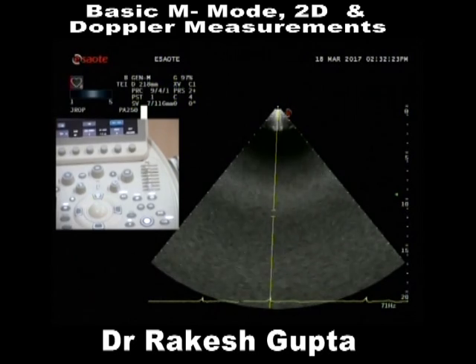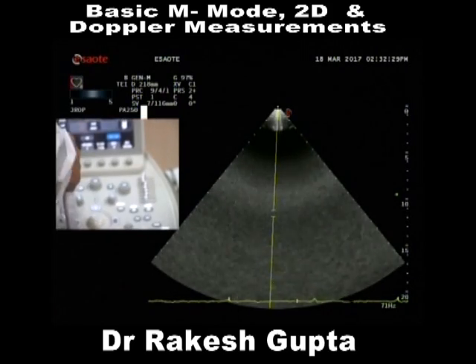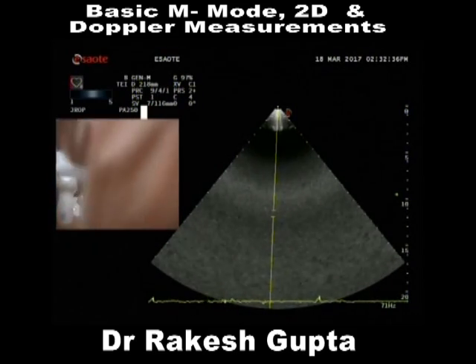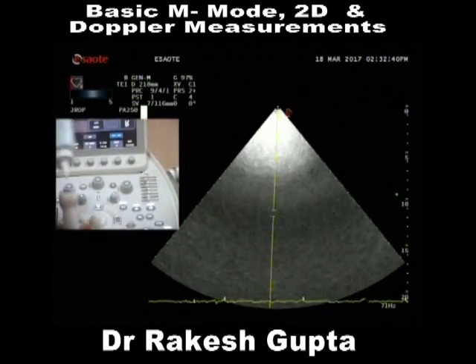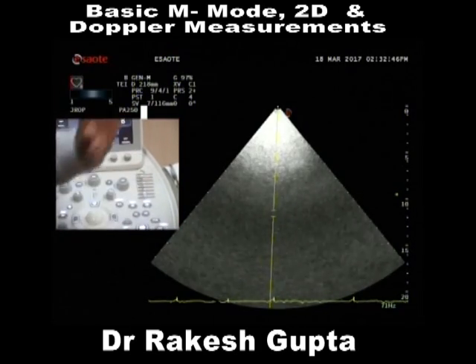And one more thing. Our humble request is please always start doing echocardiography with ECG gating.